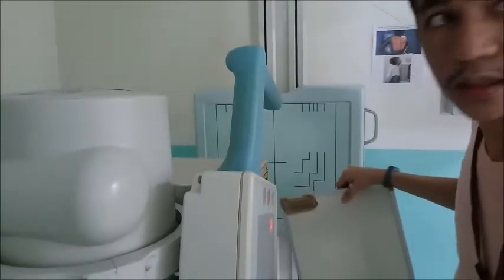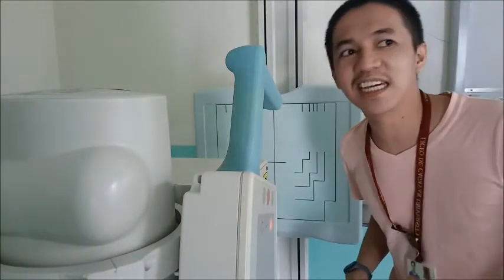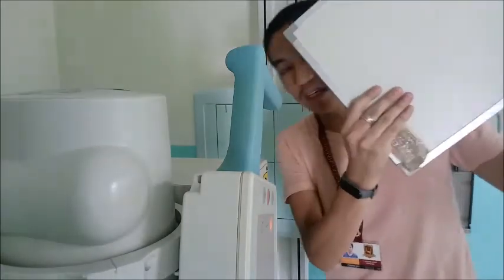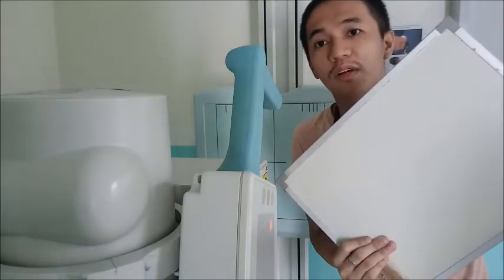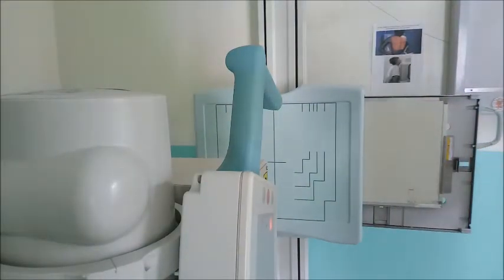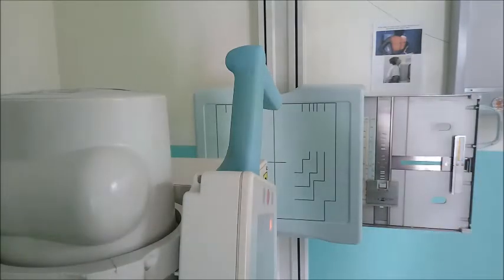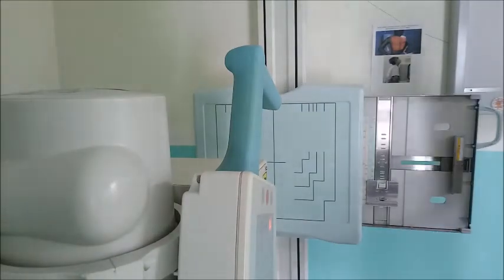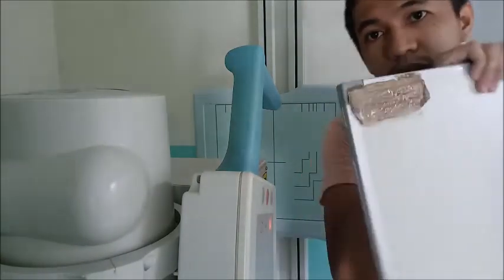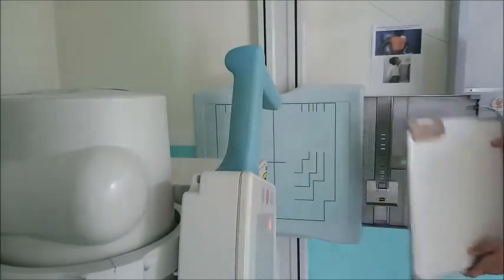It depends on your skill and experience. If you are not confident using the 11 by 14, you can use the 14 by 14, or 14 by 17. Earlier for chest PA we used 14 by 14, so it fits top to bottom. For the lateral, it also fits top to bottom.